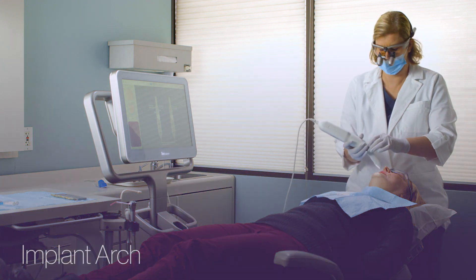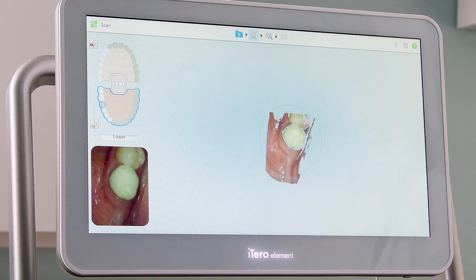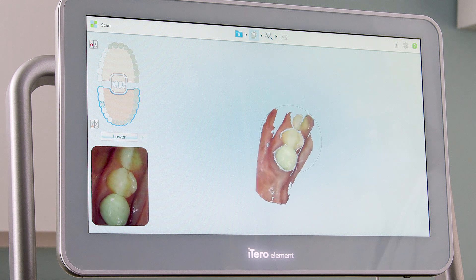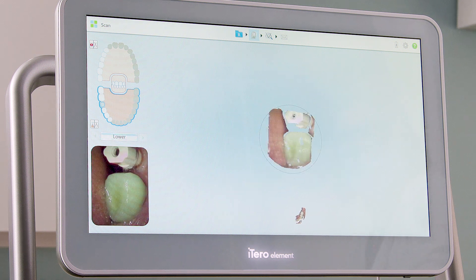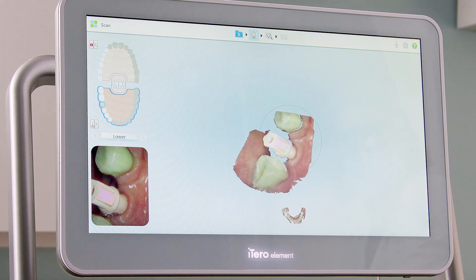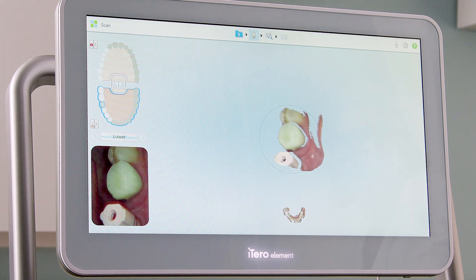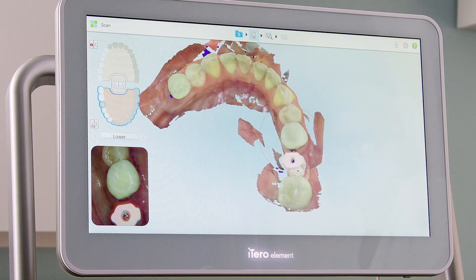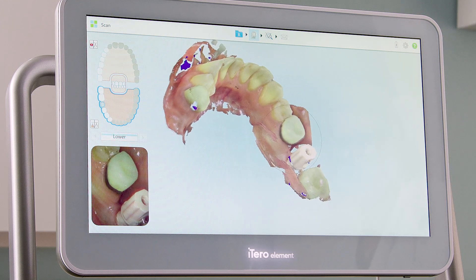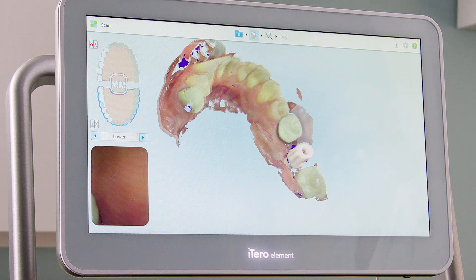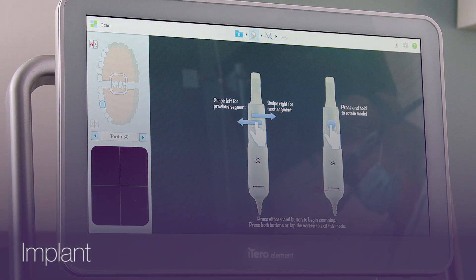The next segment is the implant arch segment. I will scan the occlusal, lingual, buccal, and adjacent contacts in this segment. The scan body can be removed if it impedes capturing the adjacent contact surfaces. The next segment is the implant segment.